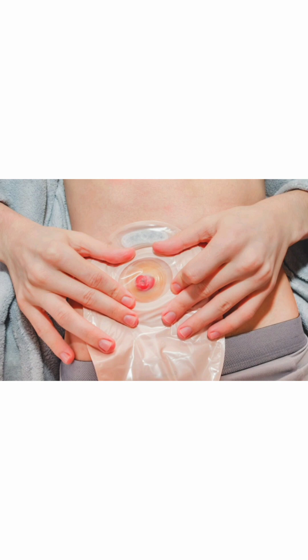So a tip for the healthcare workers as well as the caregivers and the patients who are managing the stoma: they should always use proper hand hygiene before handling the stoma bag or after doing the stoma care. Then change the pouch regularly so that there is no leakage or there is less risk of infections.